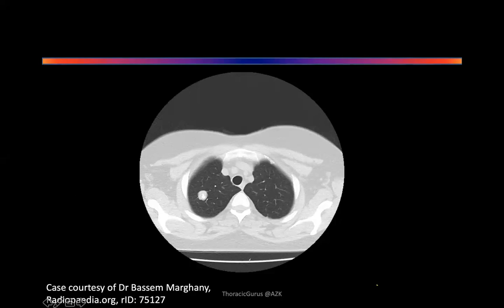Right, sir. This is a non-contrast CT, no identifiers, and the right lung field shows a circumscribed, well-demarcated, dense, radiopaque lesion, and the surrounding lung parenchyma is normal, and there appears to be calcification within. And there is no mass effect associated with that. Excellent. If I could measure that, solitary pulmonary nodule. Okay. What investigation do you want to do next?